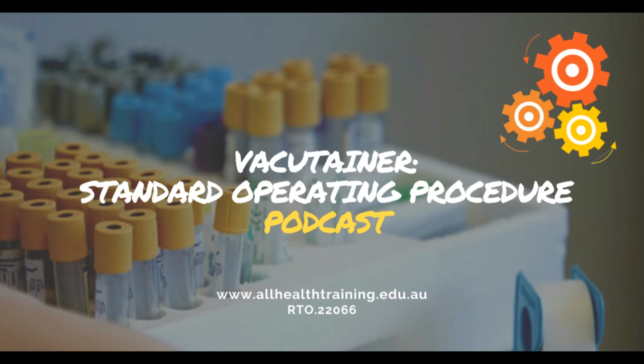You need to discard of your needle with one hand. Insert the needle into the container. Sliding from the big hole to the small. Lock it in and screw anti-clockwise. Once unscrewed, slide the barrel to the larger opening so that the needle can drop off. Place your barrel into the dirty container for washing at the end of the day.